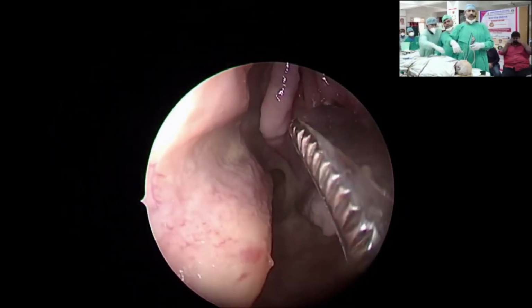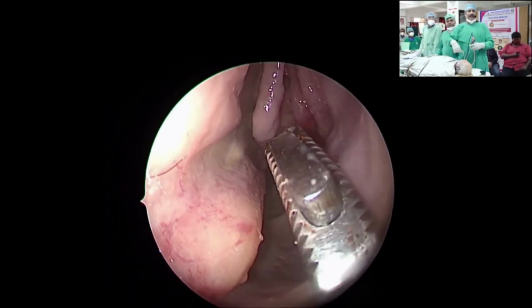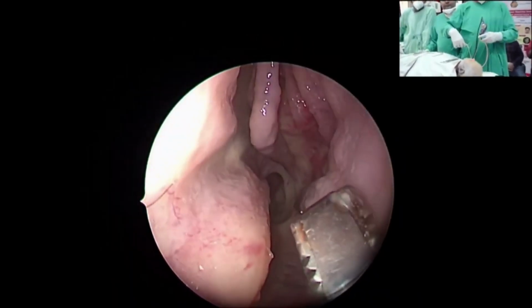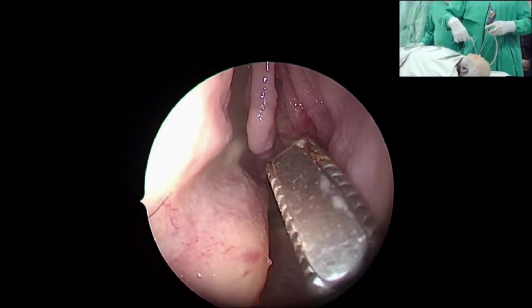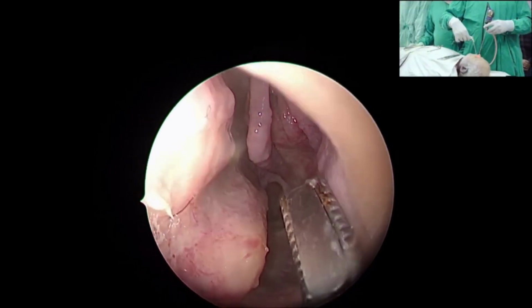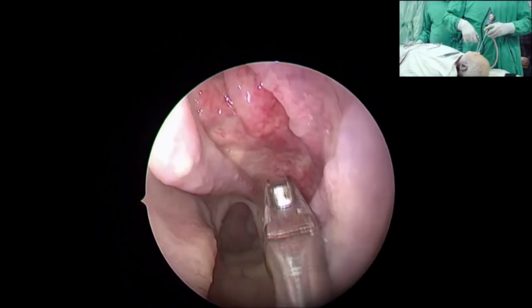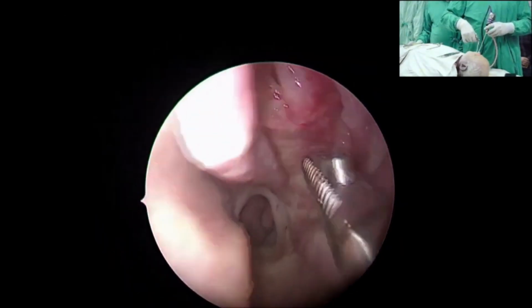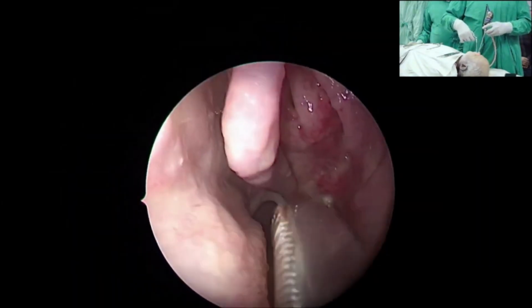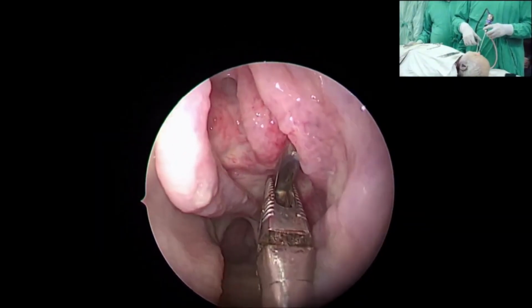So what I'm trying to show, are you getting the external camera picture? Yeah. See my hands. My telescope is going along the columella, pressing on the columella, and my instrument is going along the lateral nasal wall. So instruments are converging. Keep your instrument ahead and navigate with your telescope behind. See this? As you go in, introduce together, bring out together. So you don't traumatize the surrounding mucosal areas, which is important from a function preservation point of view.